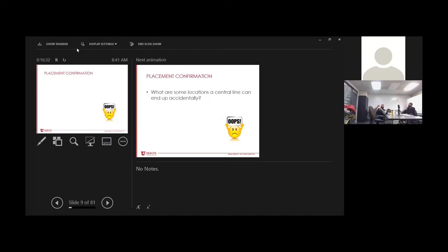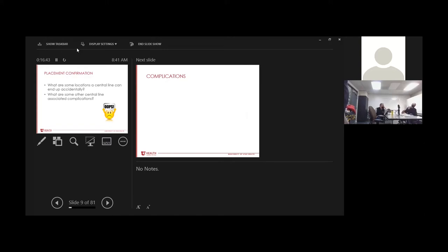I'm guessing that has a lot to do with probe angle. Absolutely, yeah. Losing your needle tip can absolutely have a lot to do with probe angle. Patients are restricted. They won't turn their head all the way to the side. So if they're like this, the carotid is pretty far away, and you've got to make a pretty big mistake. If they're more midline, if you can't turn their head, the vessels sit pretty close together.